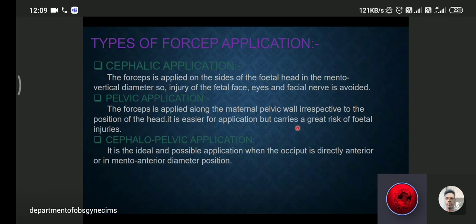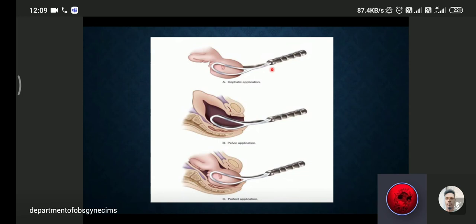And the third one and the best one is cephalopelvic application. It is ideal and possible application when the occiput is directly anterior or antero-lateral or mento-anterior position. This is cephalopelvic application: application of the forceps according to the fetal head. This is pelvic application just applied in the pelvis, and in cephalopelvic with proper assessment of pelvis and the head of the fetus, we can apply cephalopelvic application.